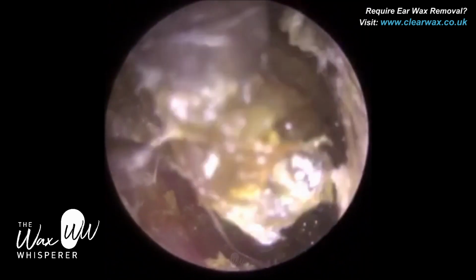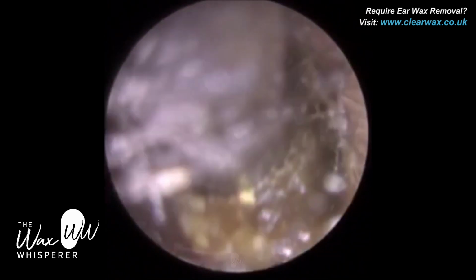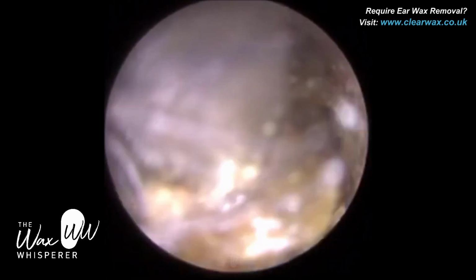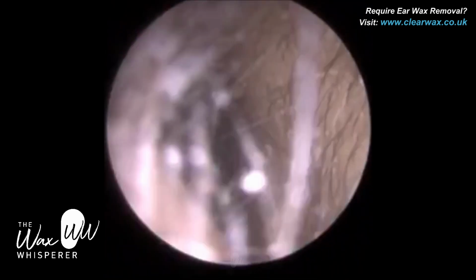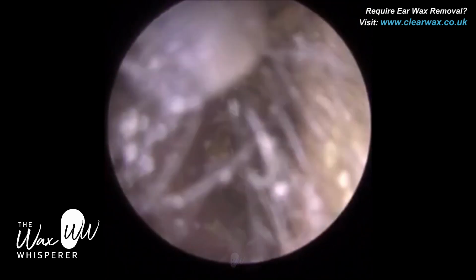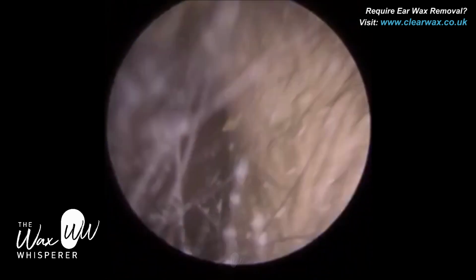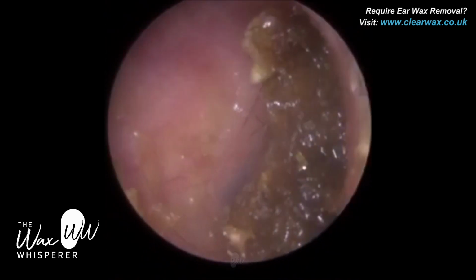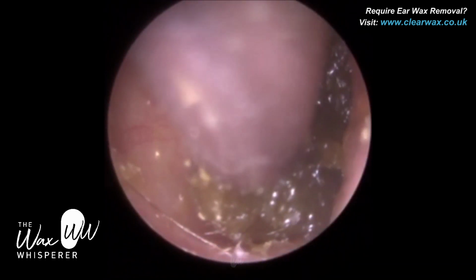So you can see I'm just gently lifting this plug of wax up in small delicate motions. Quite often when we're training people to perform earwax removal, they've got a tendency of just really smacking this suction probe right up against the wax, and all you do is clog it. So it's almost a case of kissing the surface. You can see I'm making these fine brush stroke movements, trying to lift, elevate the wax, and it's also a lot more gentle for the patient.